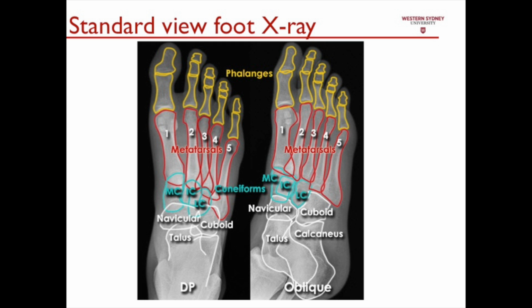Note how we will have a lack of space between the bones of the tarsus, so the cuneiforms. Note how you will see overlapping of the metatarsal bones. So please consider this when you're looking at an X-ray, and do not assume that these would be classed as fusion or lack of joint space within the bones.